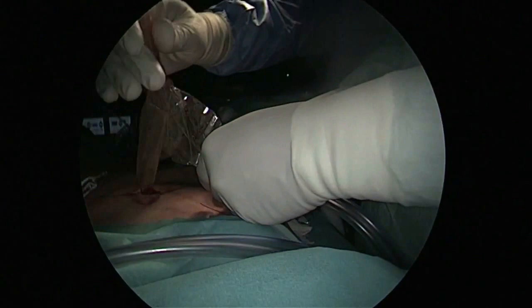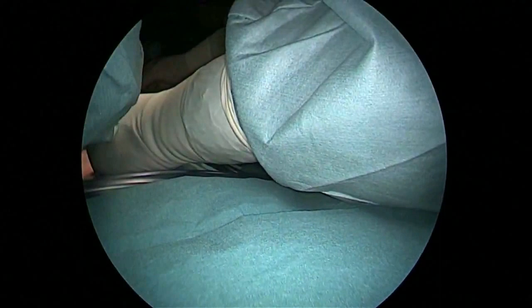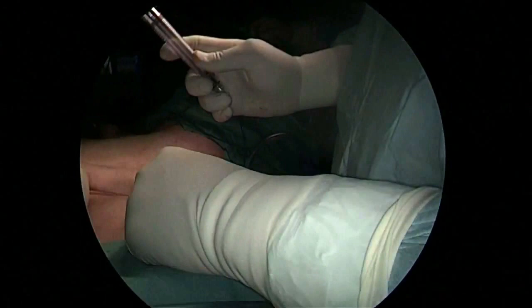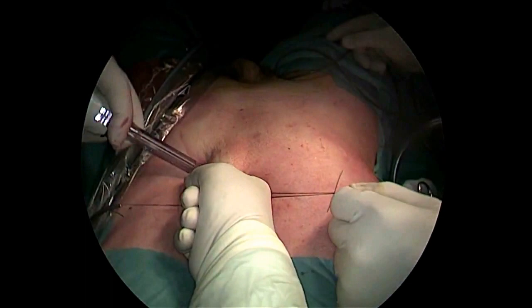And so I create the space, and now I introduce the trocars under finger guidance. The first trocar that I introduce is the 12 millimeter trocar under finger guidance at this level. And so the disposition of the trocars will be as at the end. I found this position like in a radical prostatectomy. So there is no difference in terms of trocar disposition between Millin and radical prostatectomy. This is the same technique in terms of trocar disposition.